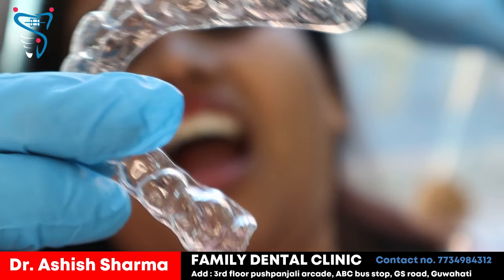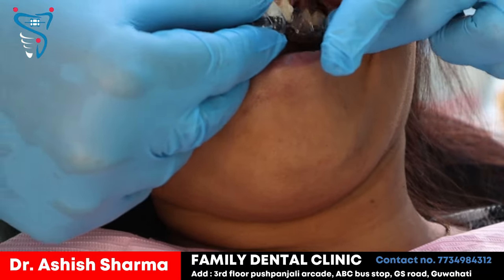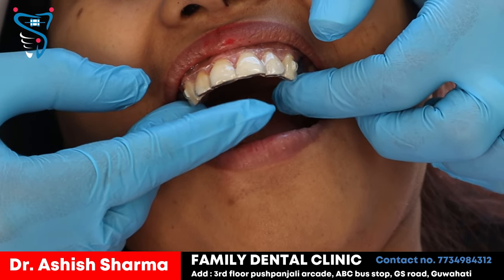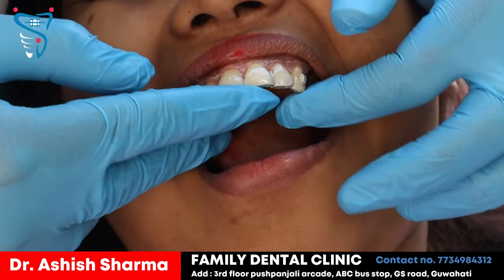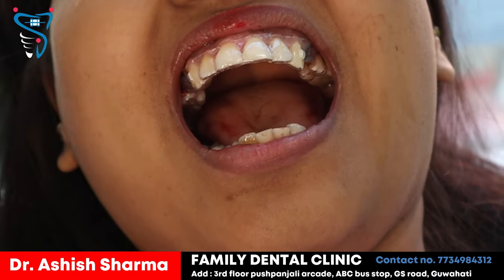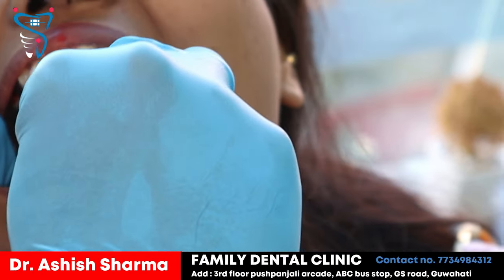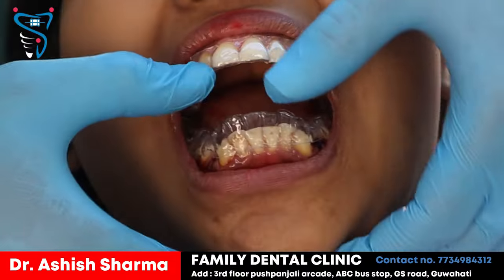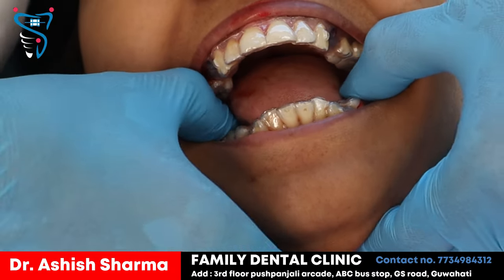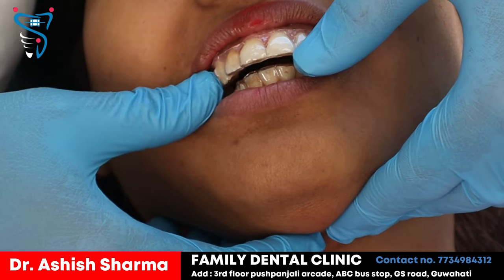This is the upper aligner which we are going to place — the first one. It's very simple; the attachment has been provided. It's a snap fit — that snap sound means it has fitted properly and it won't come loose. This is the lower one. You have to press it from here, that sound comes, and it is fitted. That's it.